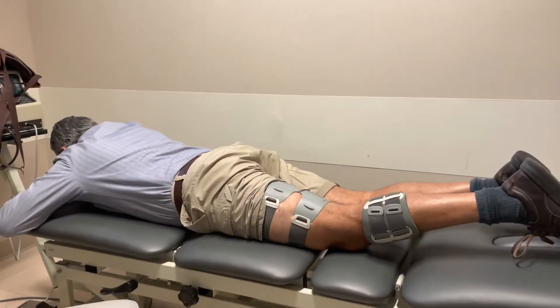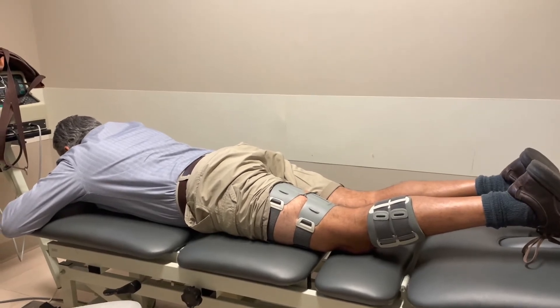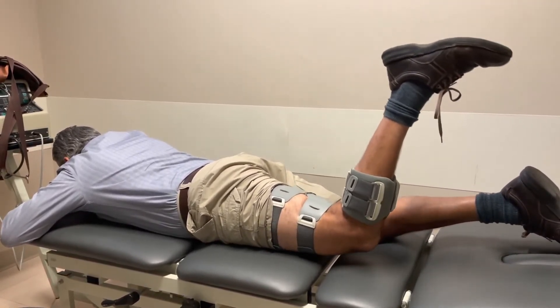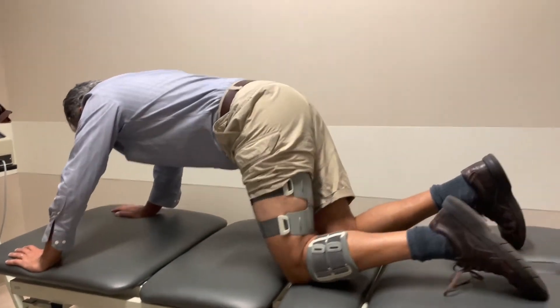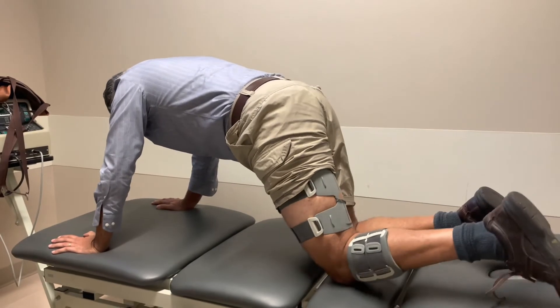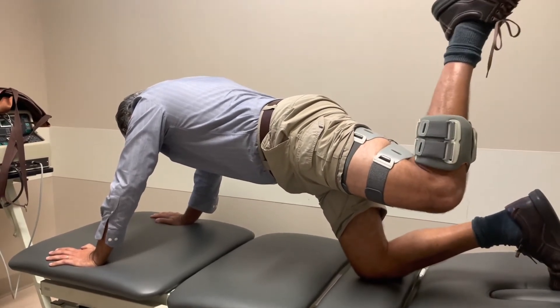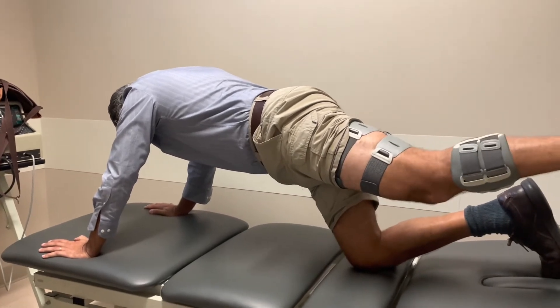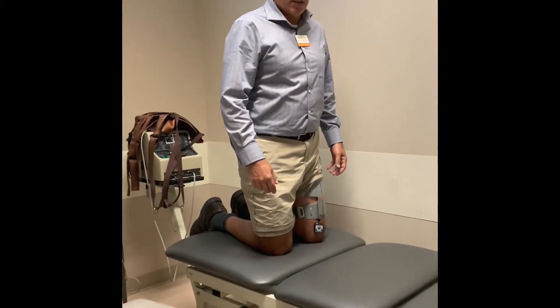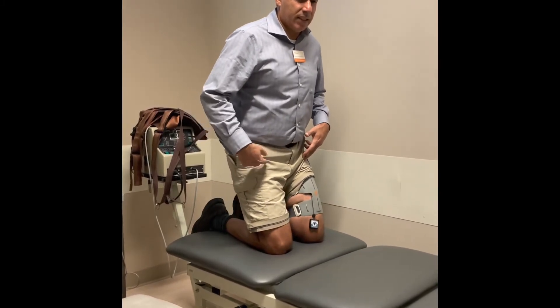Looking for some ideas in prone: we have prone hip extension with the stimulator on the hamstring, and we can also do knee flexion in prone. Then we transition to quadruped position, getting hip extension with the knee in a flexed position, and getting knee flexion actively from a hip-extended position.